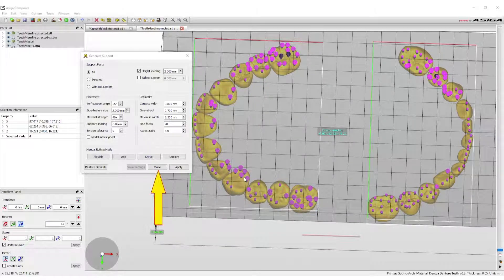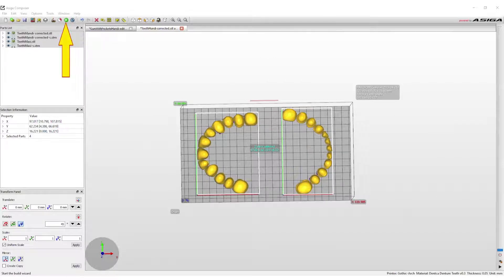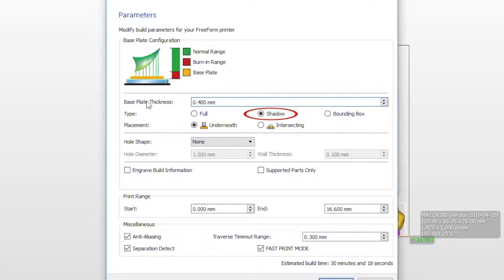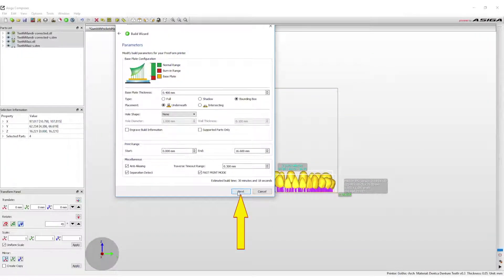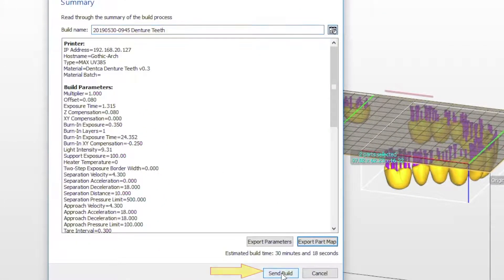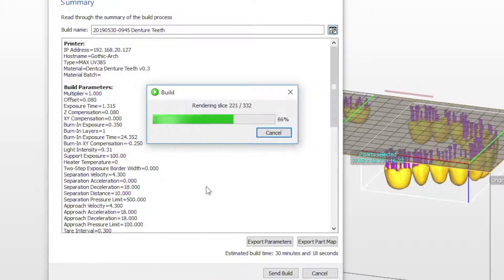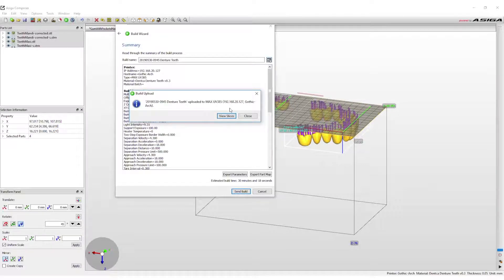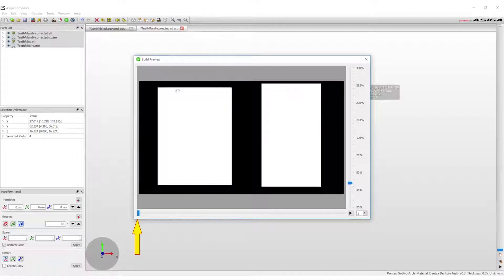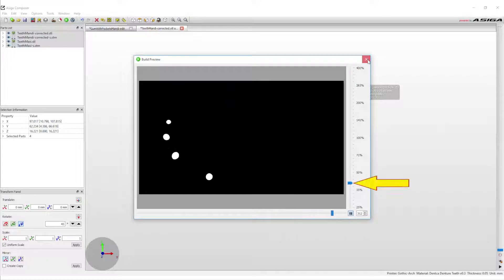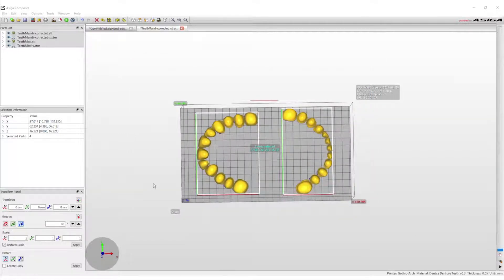Next, select Close and if satisfied with the placement, select the Build Wizard. Select Next and in the parameters window change the type from Shadow to Bounding Box. Then select Next again and in the summary the build can be named. Click Send Build and the design will be sent to the printer. When the build is submitted, the slices or layers can be viewed in the build preview. The progress arrow along the bottom can be moved to see exactly how the layers will be built. The slide on the right side allows you to zoom in and out of the printer preview. The printer will now complete the print process.